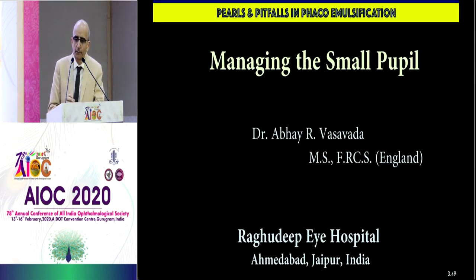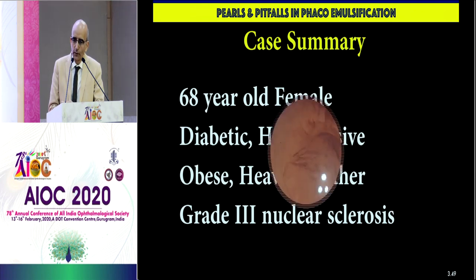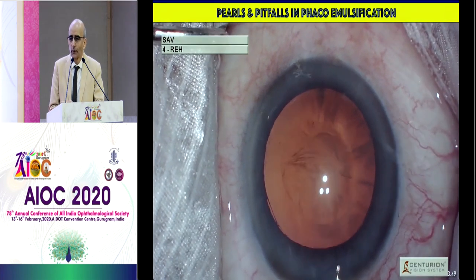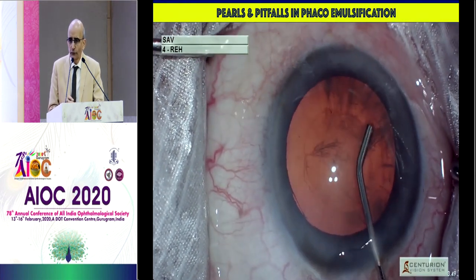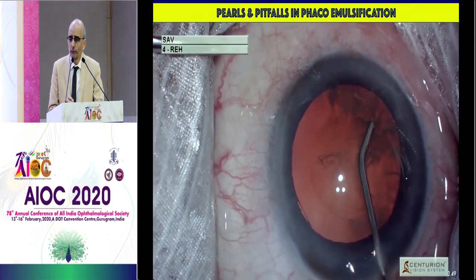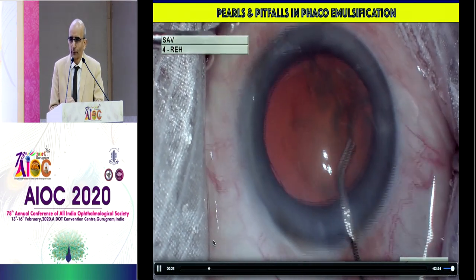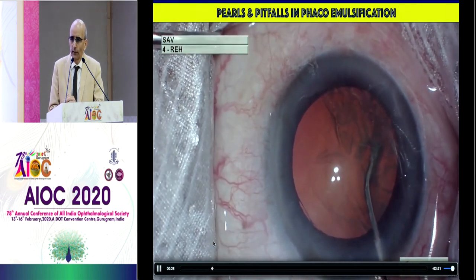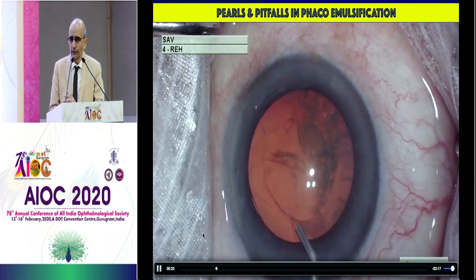This is not what Suven keeps talking about. This is the intraoperative iris trauma. This is not a correct description of the presentation, but this is a fairly common scenario in Gujarat with a lot of diabetics around. Things are going pretty smoothly and hydro dissection is important as was told previously. You need to have your way of doing it, subcapsular, but when you introduce the cannula and when you take it out, you need to be careful. This eye has a shallow chamber. Notice that.